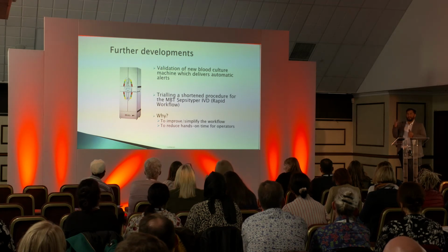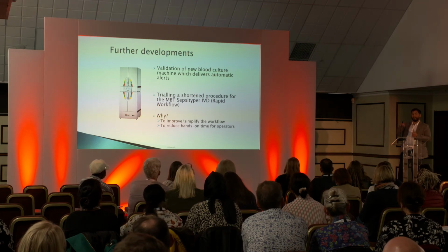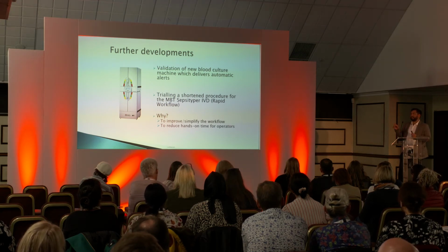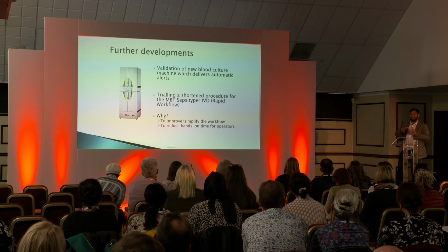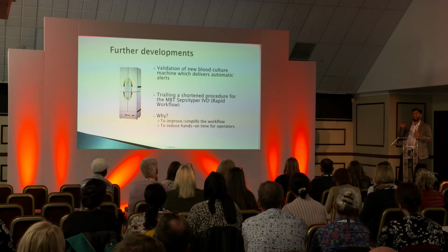In my lab, we cover the lab 24/7, so there's always someone in the lab. It's only one person, so you can imagine if you're in the lab alone, the phone's going off, the blood culture machine's going off, you've got lots to do, and you're trying to focus. So we were trying to reduce the workflow and streamline it so that it was easier. They could get that report out more quickly, as well as doing other duties too. And the main thing about this reduced, shortened method is that it's less hands-on time.